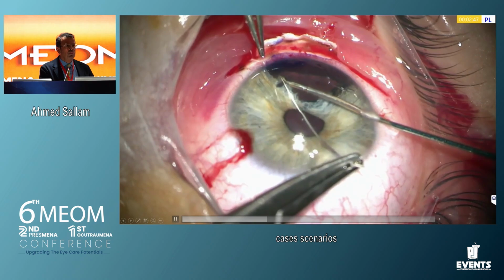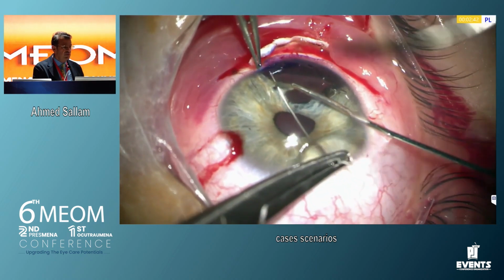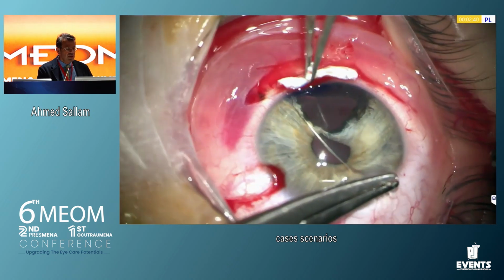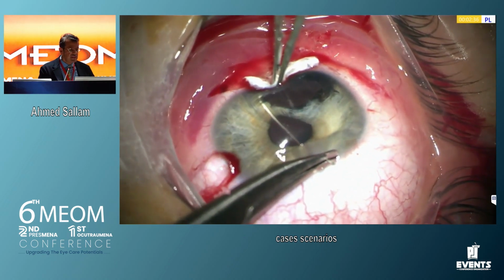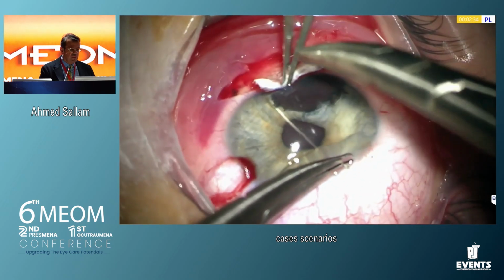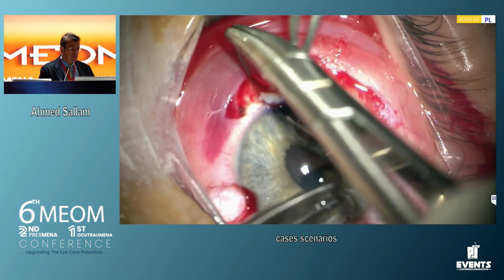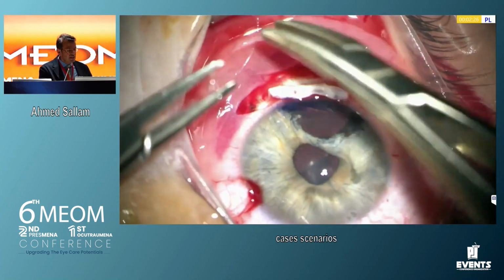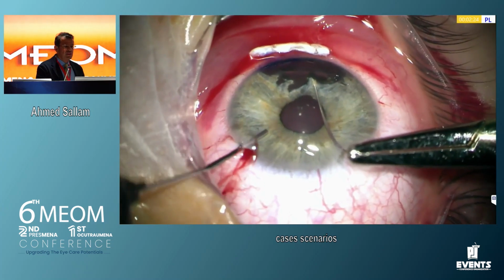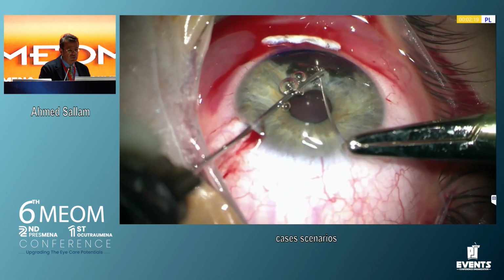And usually we would do it without a forceps, so we'd do it like catching it with a needle and out, but the problem is here you want to be able to have more fine movements because of not hitting the lens, again, in a phakic patient. And sometimes I do flaps and sometimes I don't do flaps and I just bury the needle, but here, again, because of the difficulty of getting accurate exits, I thought it's best to do flaps because we might not be able to bury all the sutures.